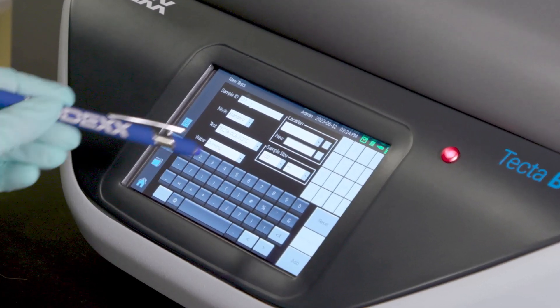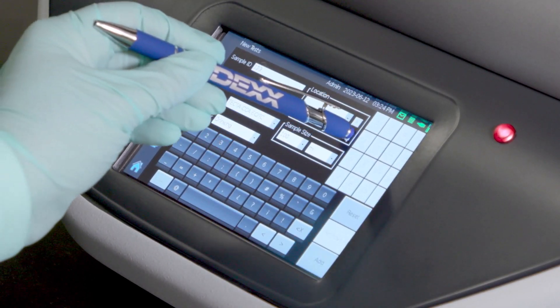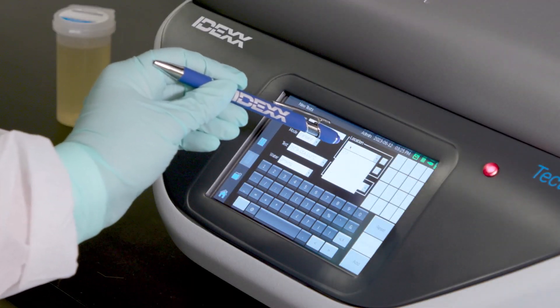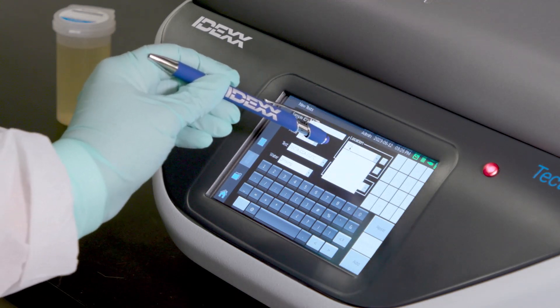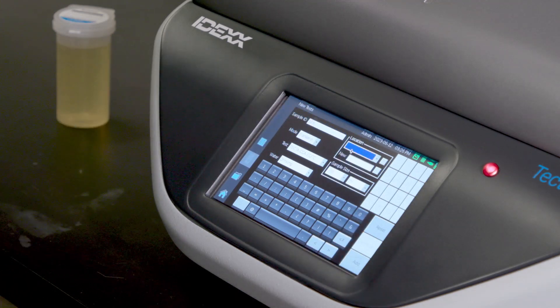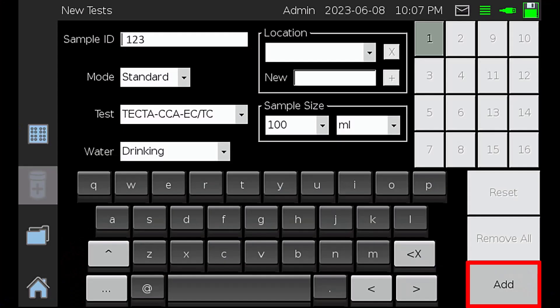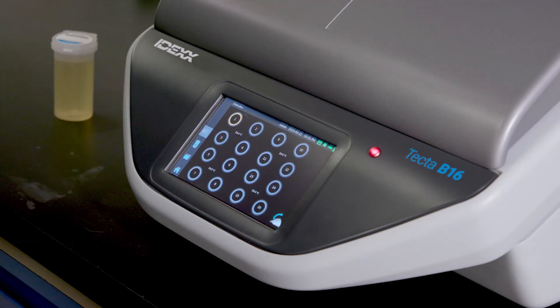Common sample locations can be added to a drop-down menu by entering a new location and selecting the plus symbol. Locations can also be deleted by selecting the location from the drop-down menu and then selecting the X symbol. Once all sample details are added, select Add. The TECTA instrument will allocate the next available chamber for that sample. Select the Overview icon — this will show the overview screen with the selected chamber showing a blinking yellow icon.